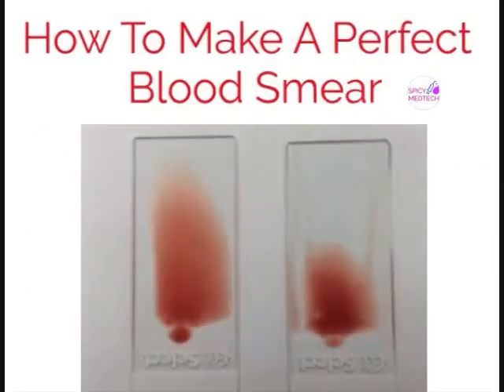Take a look at these two slides. The slide on the left had a shallow angle, while the slide on the right had an angle that was too steep.